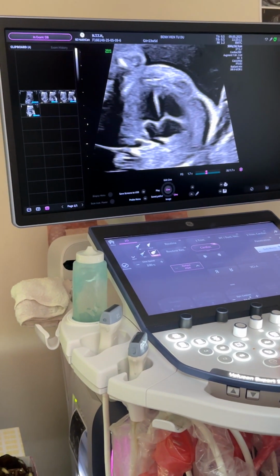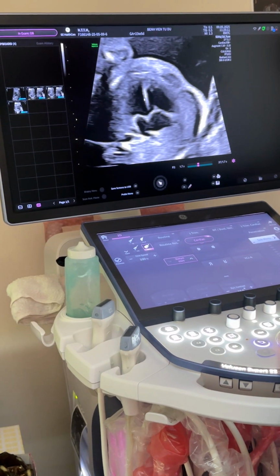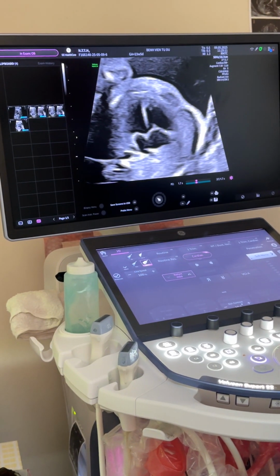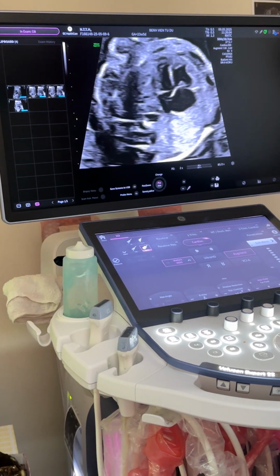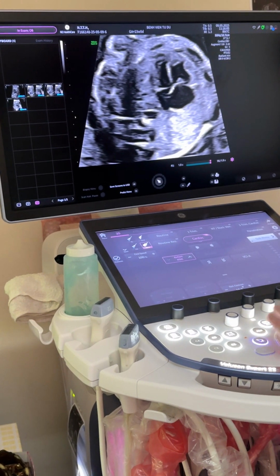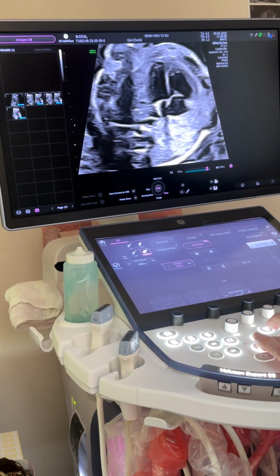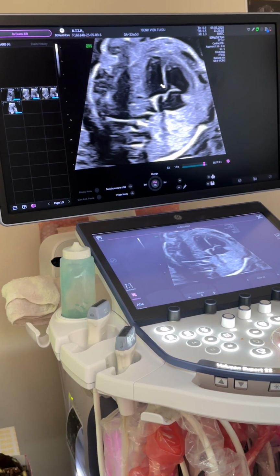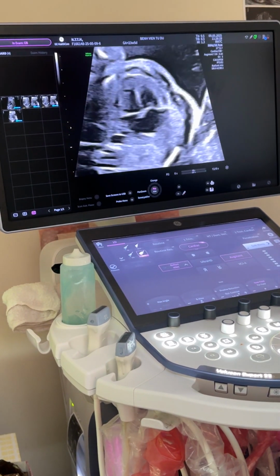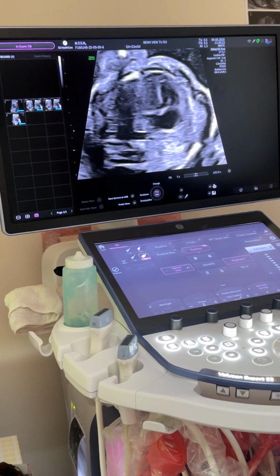okay. When I look at the ventricles, I look at the shape of the left ventricle, which is narrow and slender, and the right ventricle, which is wider. There's no pericardial effusion. I'm still seeing dropout in the region of the ventricular septum, in the perimembranous portion of the ventricular septum. But when I'm seeing this, there is no edge enhancement. So it's probably a false positive diagnosis. But I need to check, because I keep seeing this dropout in the ventricular septum.